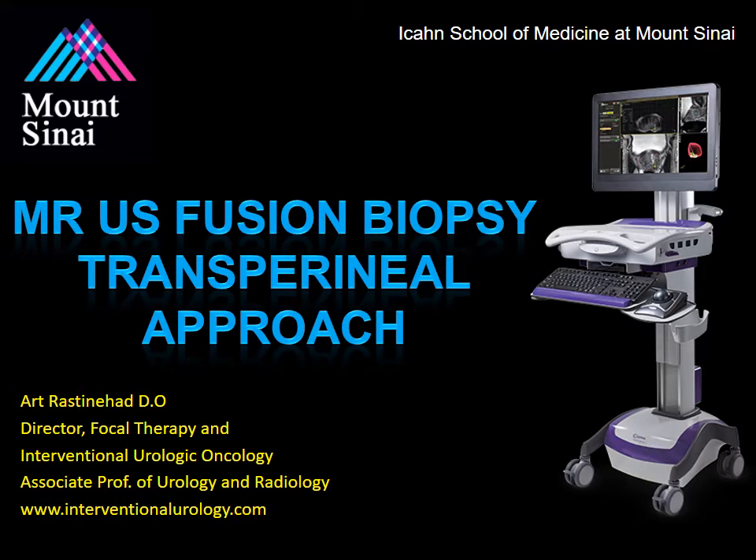Hello, my name is Dr. Art Rastonat, and today we'll be reviewing how to perform an MR Ultrasound Fusion Guided Biopsy using the Transperineal Platform by UroNav.